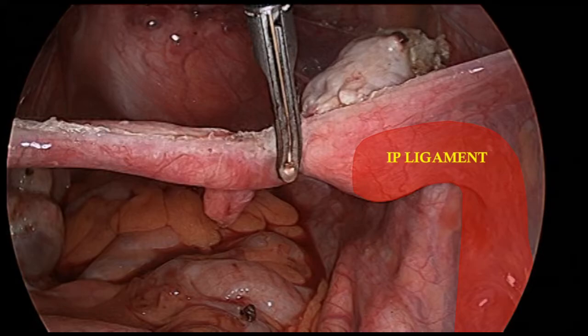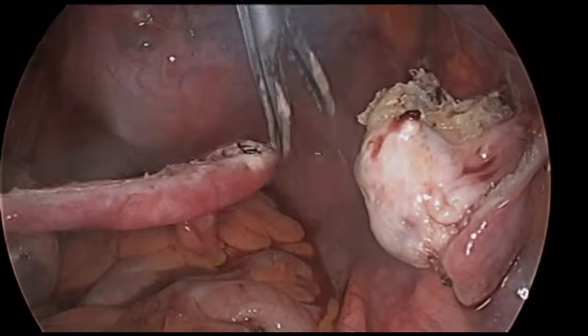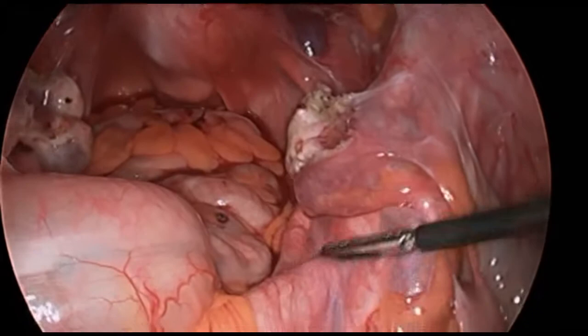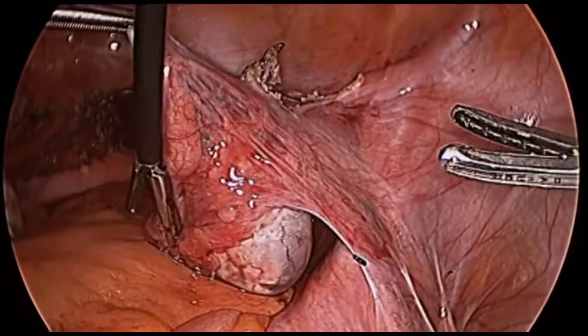Dissection proceeds directly adjacent to the fallopian tube, taking care to avoid the IP ligament. Steady, gentle traction provided by the surgeon allows for efficient dissection. The area of dissection is thoroughly inspected for hemostasis. Both the IP ligament and the ureter were safely away from the area of dissection.